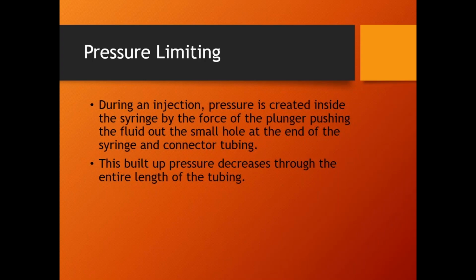I'm jumping ahead of myself just slightly here, but there's connector tubing here, all right? Thin connector tubing. And that one goes there. This one goes here. So we've set up this injection, and this actually goes to the patient, to the IV needle. So that's how everything's set up. So this is a 200 milliliter syringe.